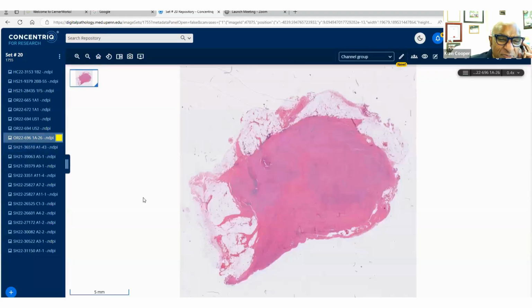Some of you may find this pretty straightforward, but it's interesting, and we often get biopsies from these tumors, and I always resort to immunohistochemistry to work through them. This is a thigh mass. Sorry, I don't have an age. I have an adult male. Thigh mass, 1.6 centimeters in the thigh.